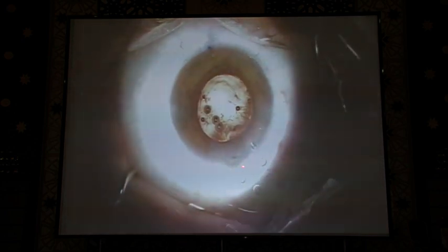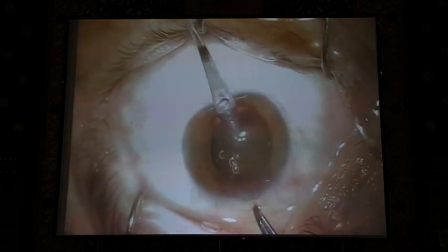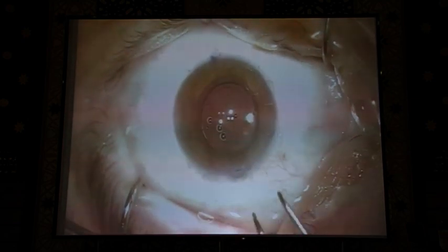Just when you inject the IOL, at the end of the surgery, these are the two markers. This is one, and here is the second one. At the end of the surgery, you can add another incision here. Because this patient has astigmatism of 2 diopters, you can see we are enlarging the size of the incision to more than 2.8 millimeter. Thank you very much.